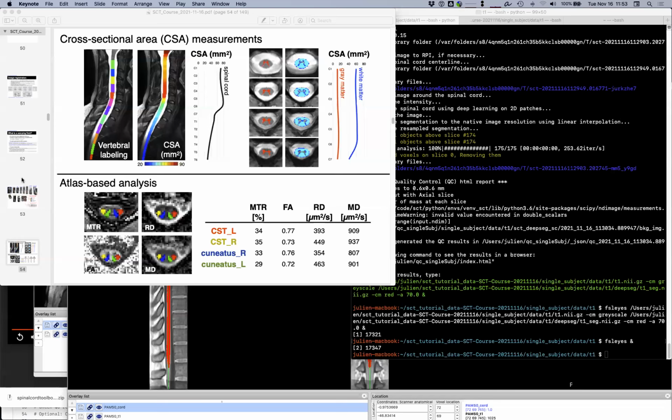We only estimate the location of the corticospinal tract based on probabilistic atlases that were done in tracing studies from ex vivo data. So this probabilistic white matter atlas is really based on previous work from the literature, from tracing studies, because so far there is no method that enables us to know exactly where the fasciculus gracilis, corticospinal tract, and rubrospinal tract are located for each individual patient.